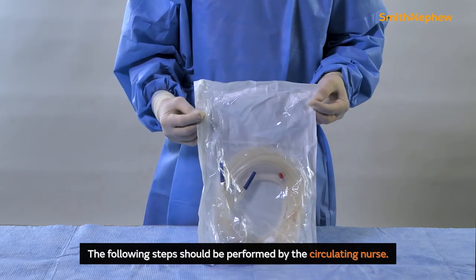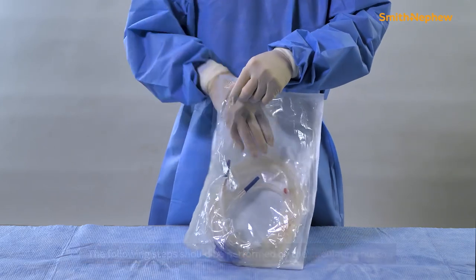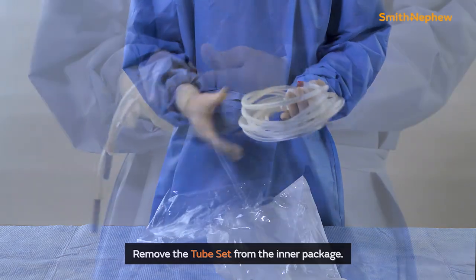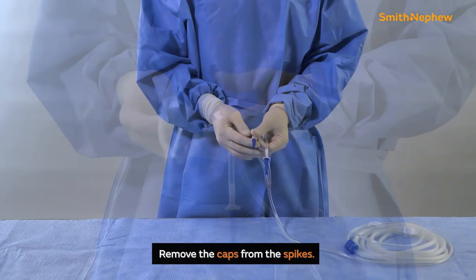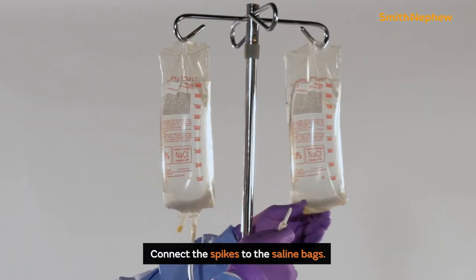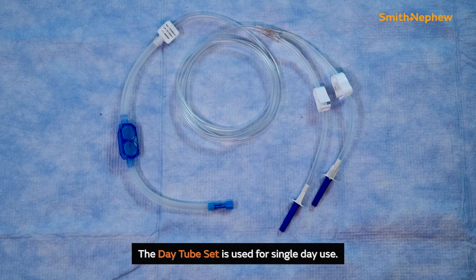Pertaining to any of the assortment of tube sets offered, the following steps should be performed by the circulating nurse. Open the outer package by using the tab. Remove the tube set from the inner package. Close the two clamps on the tubing. Remove the caps from the spikes and connect the spikes to the saline bags.